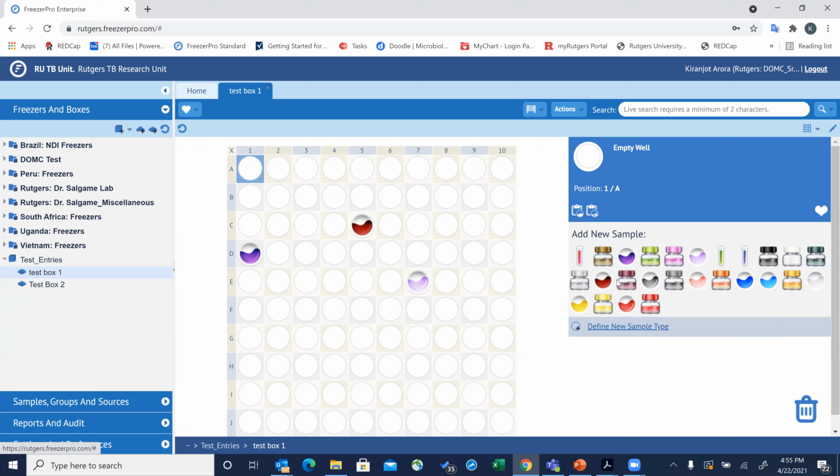All right. And another thing is all of these samples are organized alphabetically based on their name. So, the first one is dried blood spot for NOD. Then comes the gastric aspirate pellet for NOD. These ones from here, MTB isolate for FEND-TB adult till here, which is NTM isolate nasopharyngeal aspirate for NOD PED study. All of these are basically different isolate sample types.